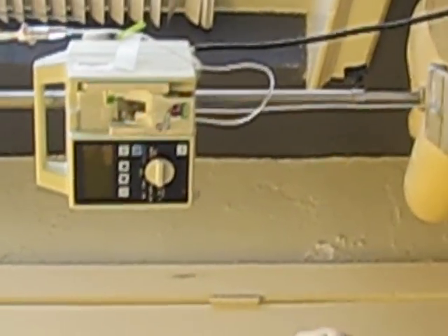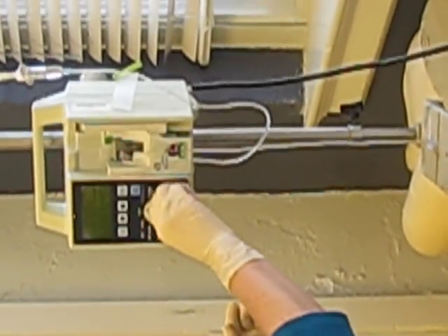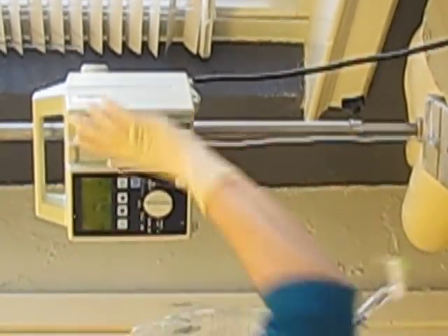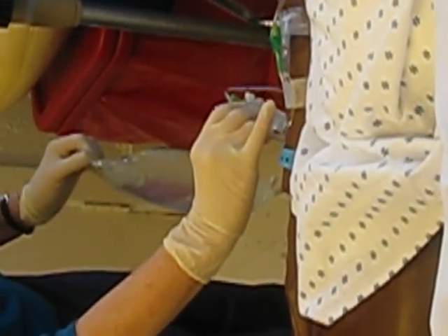So we change tubing and bag, and bag to bag. What if we want to check an occlusion? So we've got it on run — you want to keep it on run. Let's take it out of the cassette, out of the pump, and lower it below the level of the patient. See if we get a flashback of blood. If we do, we don't have an occlusion — we don't have a clot in the end of it.